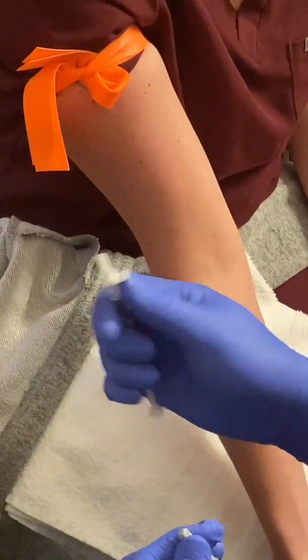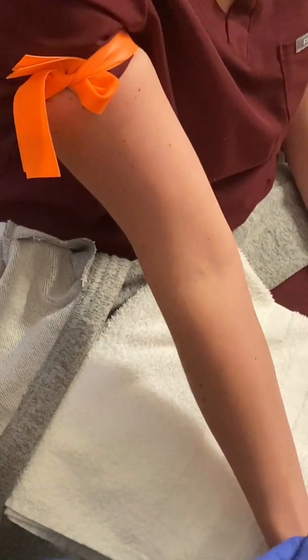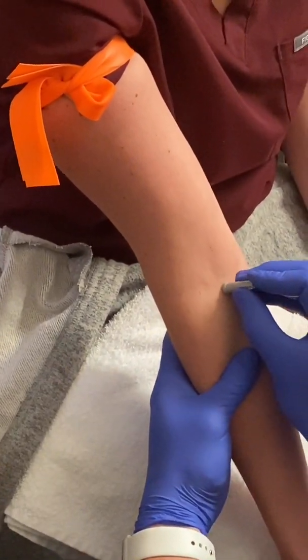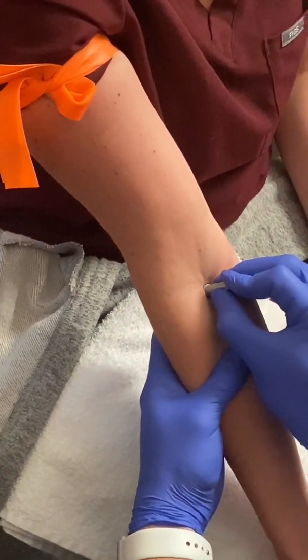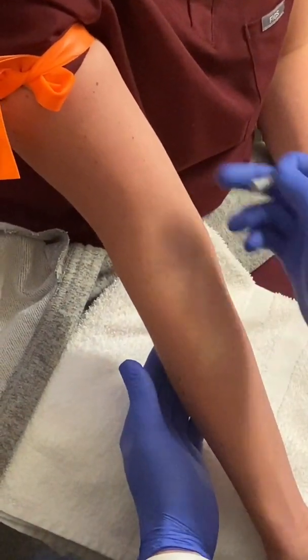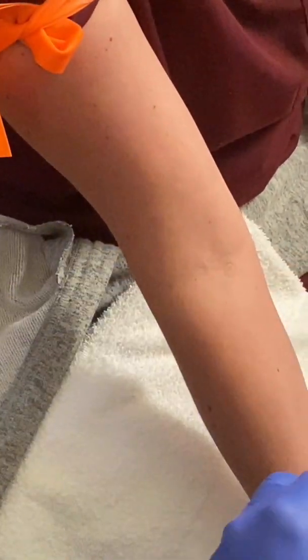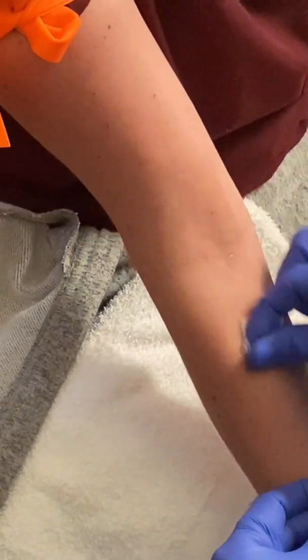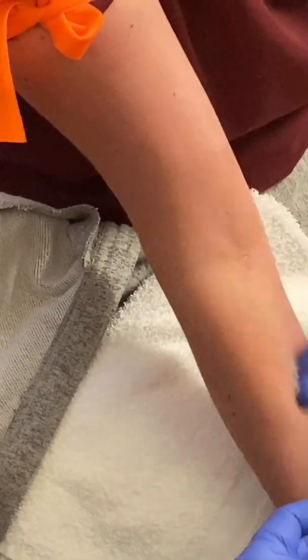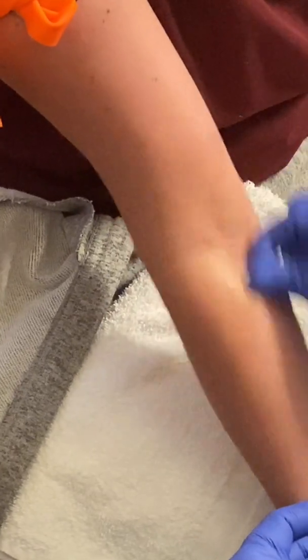With the lidocaine, I tend to make a mark with the cap at the base of the vein where I can feel it. This gives me a target and a location for my lidocaine, but also for the direction of my vein. Alcohol. Nice little scrub.